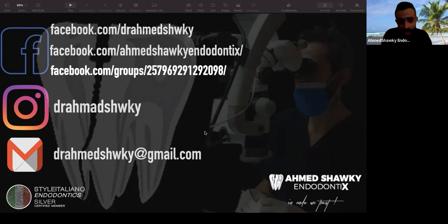The second question is, which motion do we use with these files? Continual rotation or reciprocation. I told you in the presentation that it's designed for forward or clockwise 360 rotation. So this is the usual and the basic motion. But if you try to modify your treatment approach, you can use it in reciprocation, and you can use it in combined motion based on having a device like I showed you today, the ZRF, because it has the option of selecting between different motions, but it is designed for continuous 360 clockwise rotation.